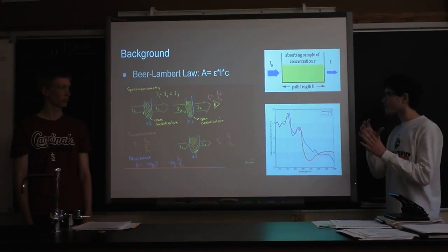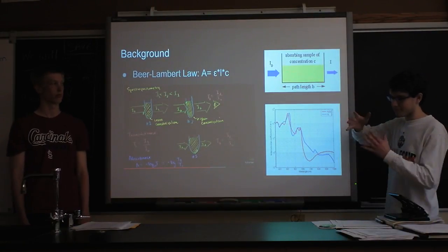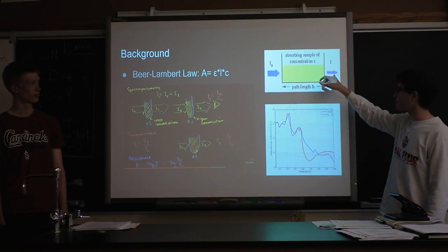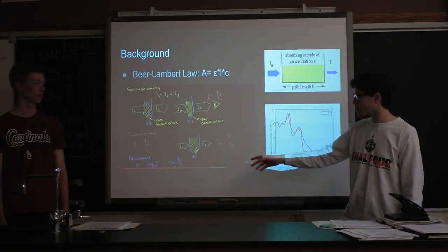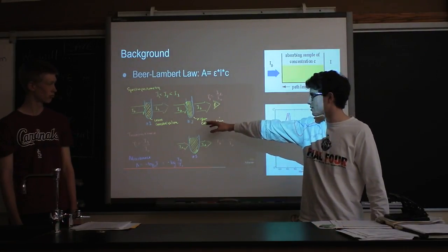When you pass light through a substance in some kind of holding device, the initial intensity of that light and then the final intensity of that light is going to be somewhat proportional to the absorptivity of the substance.